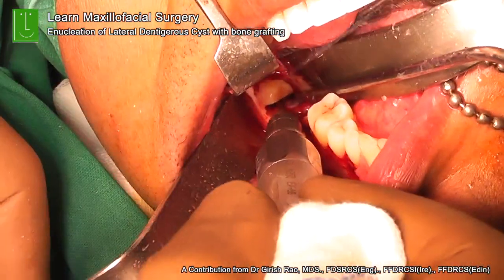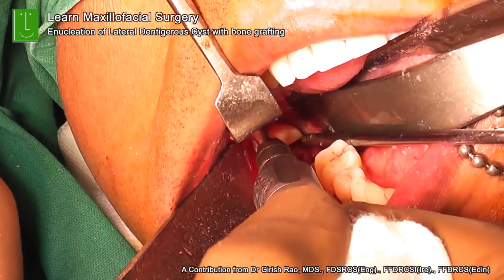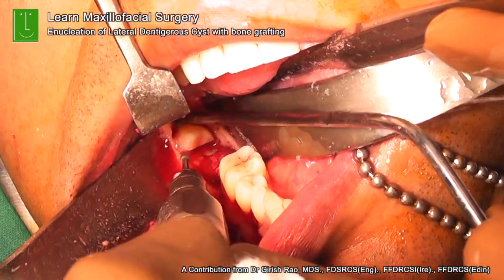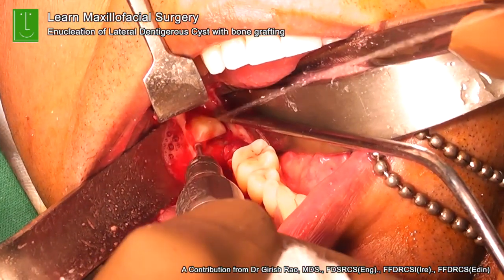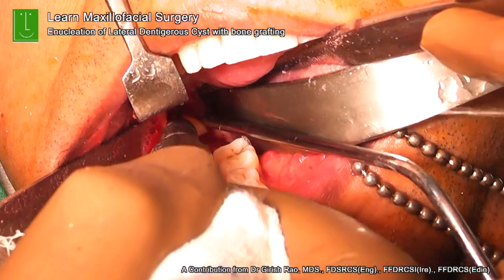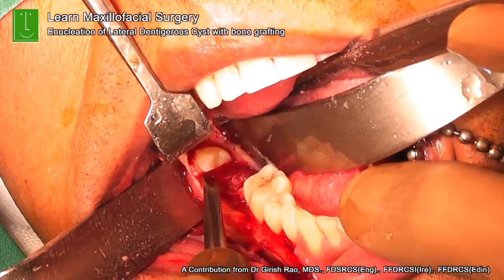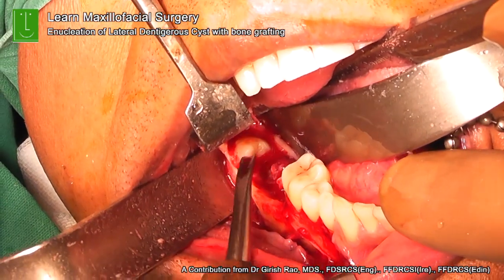The wisdom tooth, which is displaced, can be a challenge. So it's a good idea to section the wisdom tooth, and guttering around the wisdom tooth will minimize the amount of bone which is removed to get the wisdom tooth out. Using a simple Coupland elevator, the split tooth is gently teased out.